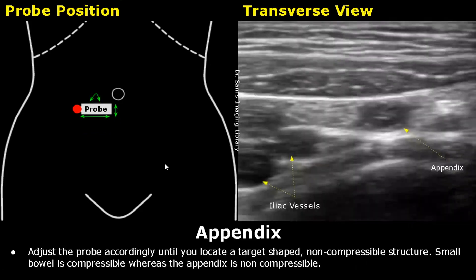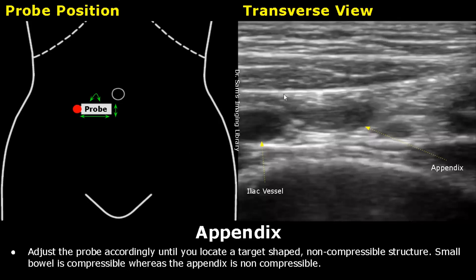Adjust the probe accordingly near the umbilicus until you find a target-shaped, non-compressible structure — this will be the appendix. The appendix can be distinguished from the small bowel by compressibility; the small bowel is compressible when we apply probe pressure. The appendix gives a target sign appearance in transverse view. With slight adjustment of the probe, we can see the tubular shape of the appendix right here, near the iliac vessel.